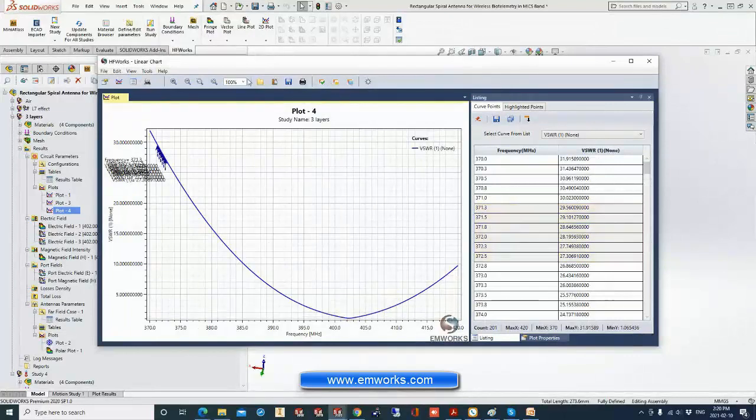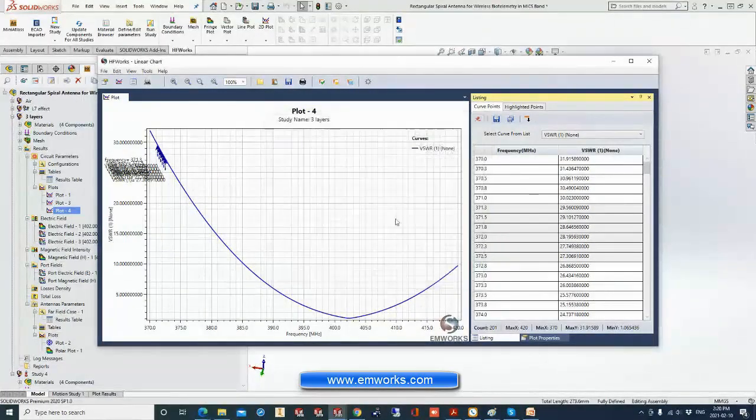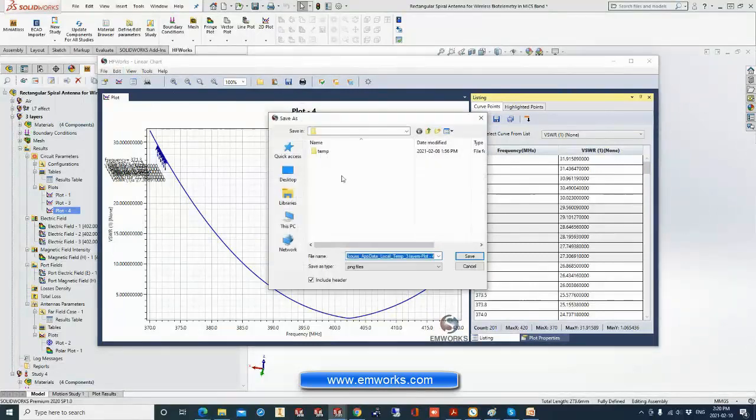So we can get the list. We can save the data points in Excel format or text format. Also, it is possible to save the plot as a picture. It can be PDF, bitmap, JPEG format, or any other format.